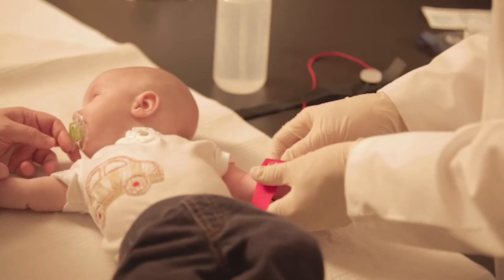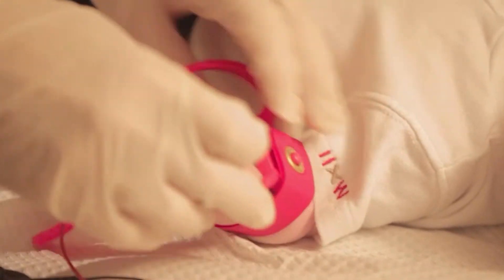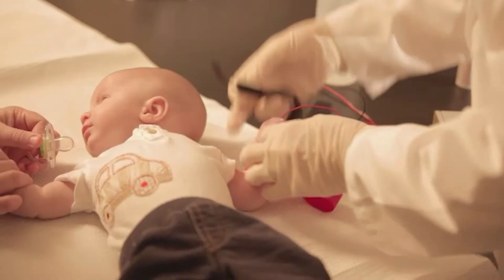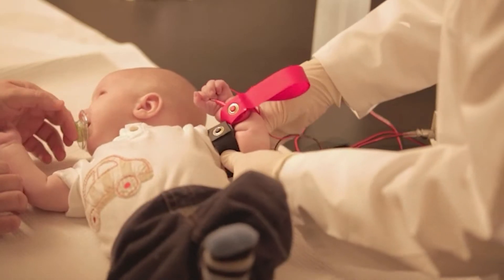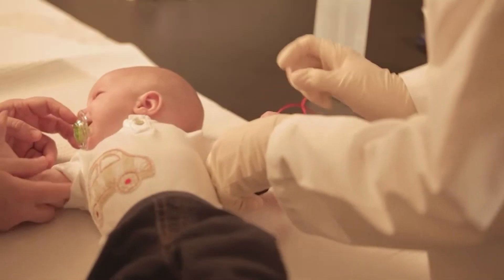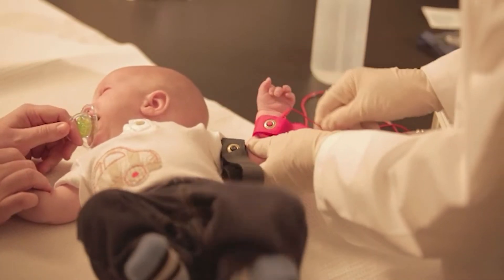Place the discs on the electrodes. Place each strap so that the stud of the electrode protrudes from the rivet of the strap, with the hook portion of the short tab facing upward away from the skin. With the positive red electrode on the lower arm closer to the wrist, place the black electrode with pilot gel disc in the electrode above the red electrode.